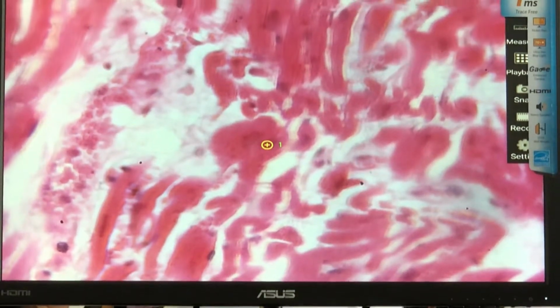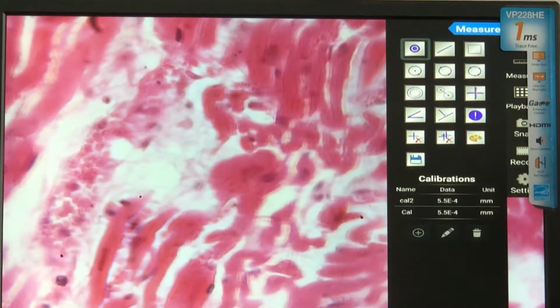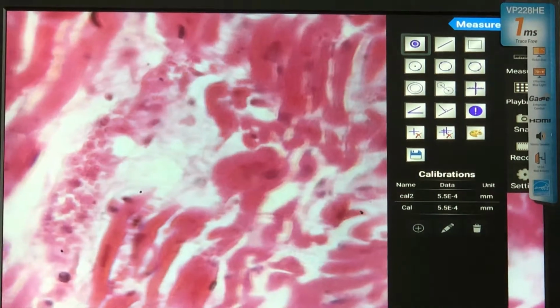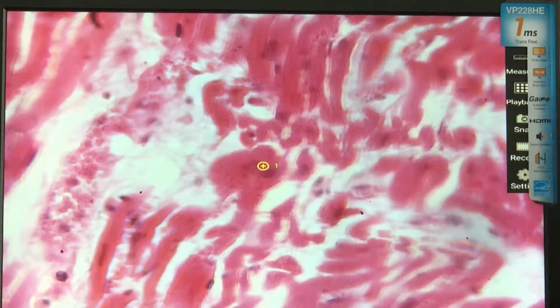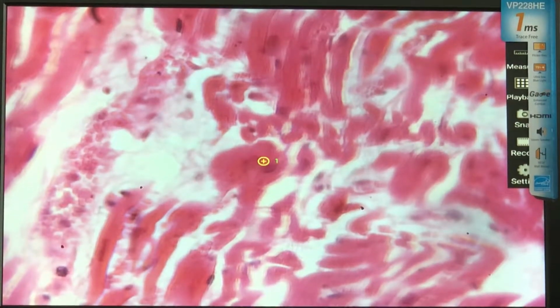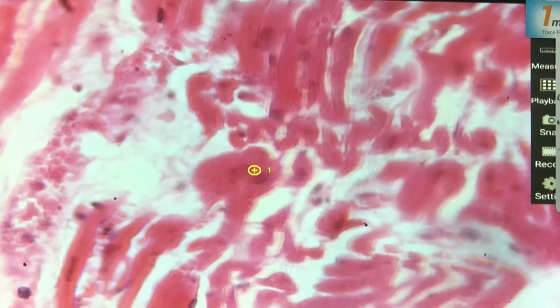When I remove that pointer, you see that one? Tip of pointer 1, 5 o'clock of the tip of pointer 1, that violet structure over there. When you compare that nucleus to a normal cardiac tissue, that nucleus is very tremendous. It's already gigantic.